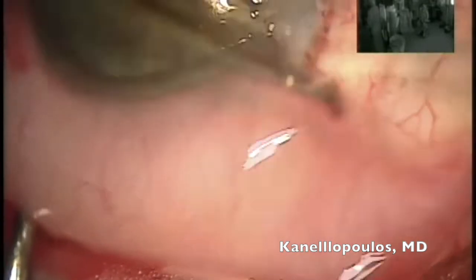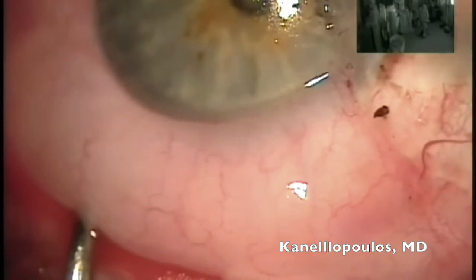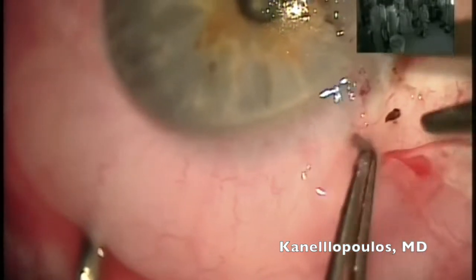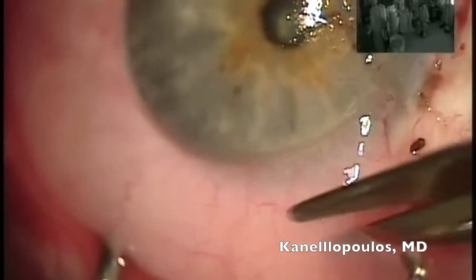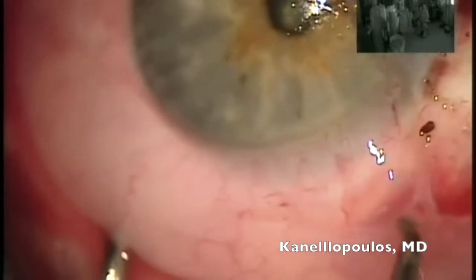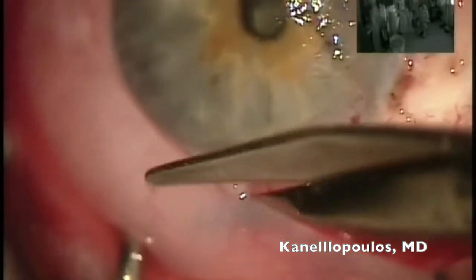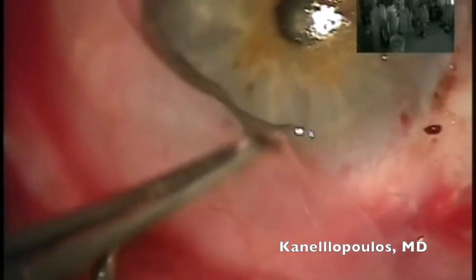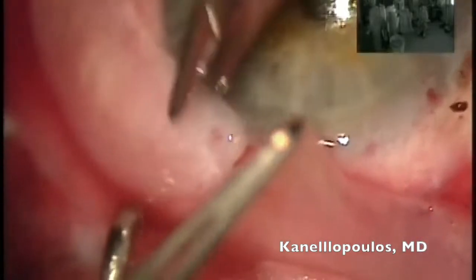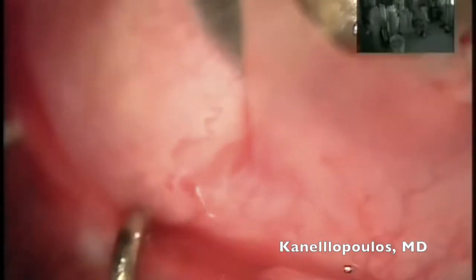I'm ballooning the conjunctiva here again with normal saline. I'm going about three to four millimeters superior of the limbus and excising the inferior part of my rotating flap. It's going to have a horizontal length of about 12 to 13 millimeters — a little bit more than the diameter of the cornea — and a vertical width of about four to five millimeters. I'm cutting vertically here, and I am now releasing the free edge of my rotating flap.